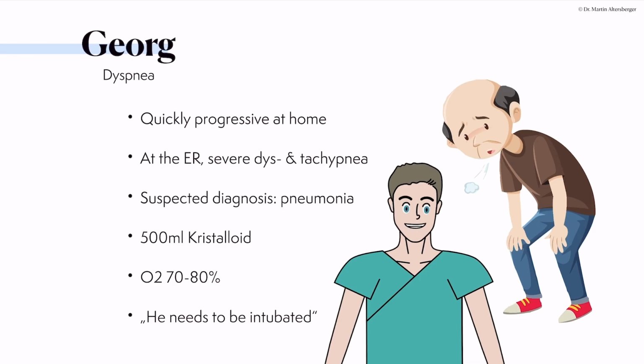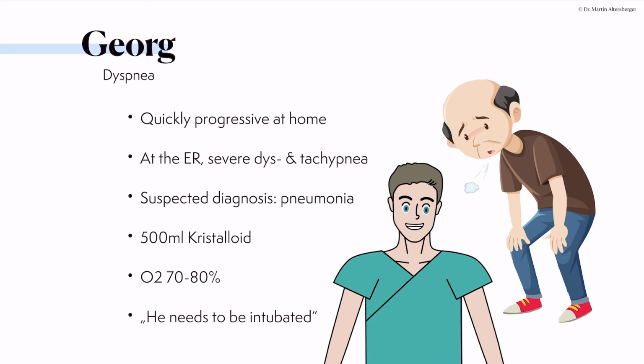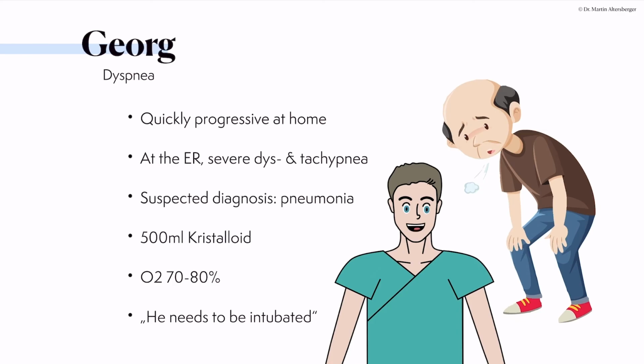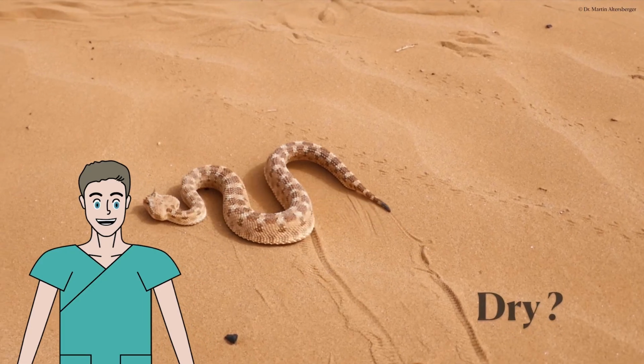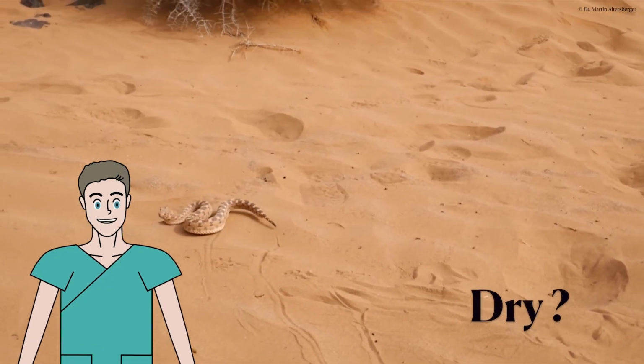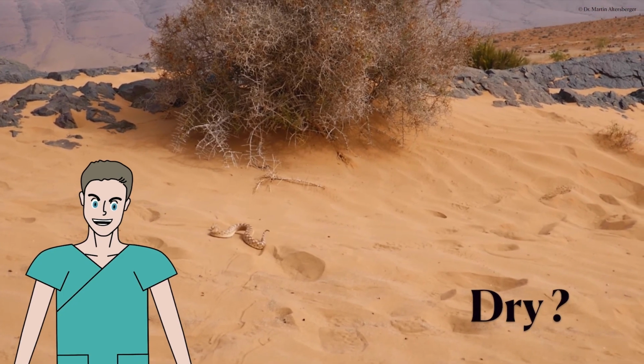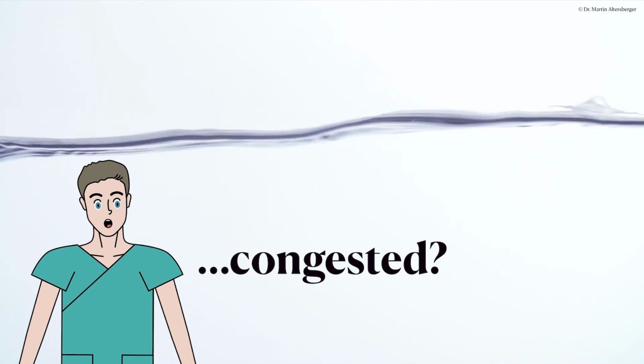The suspected diagnosis from the emergency department is pneumonia, and there he got 500 milliliters of a crystalloid. His oxygen saturation, even with oxygen, is really bad, approximately 70 to 80%. The recommendation from the emergency department is that this patient most likely needs to be intubated. Well, let's take a look and figure out: is this patient really dry, and is the dyspnea because of his pneumonia, the initial diagnosis we reported, or is he really congested?